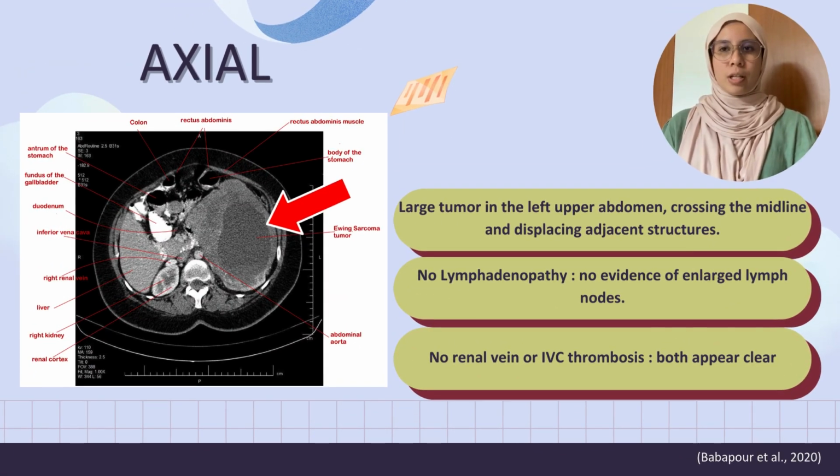Assalamualaikum, my name is Siti Nur Alia Afika. So I will continue for the axial slice. Okay, so the axial image shows a large tumor in the left upper abdomen. It crosses the midline, extending beyond the left kidney.